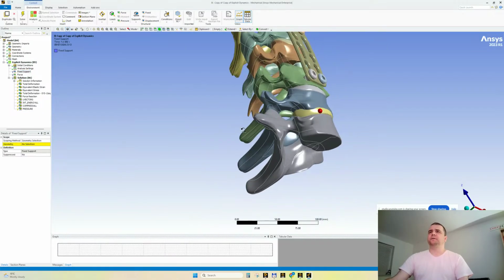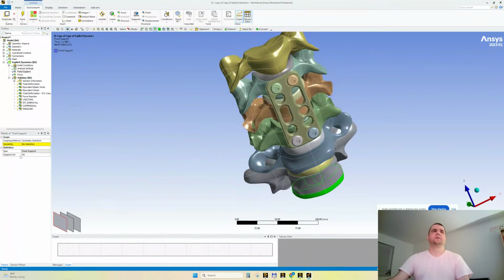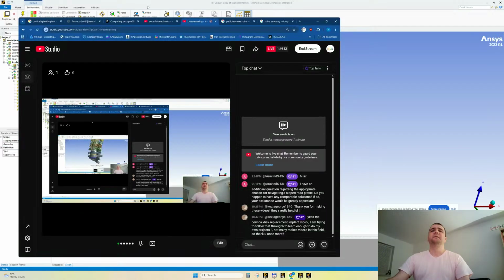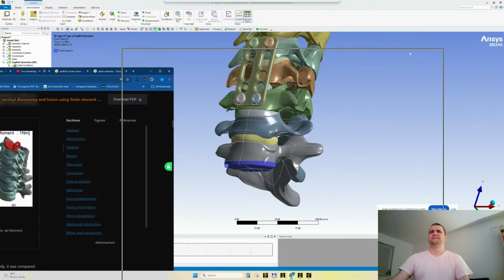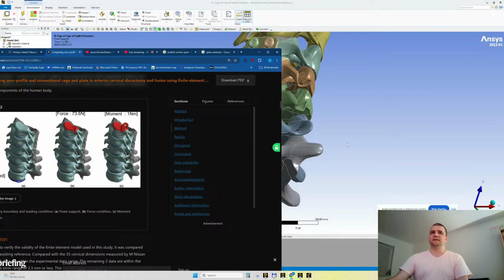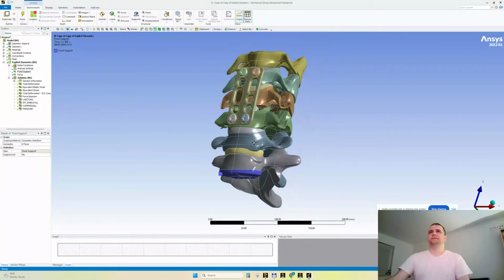In that paper, the bottom faces were fixed. Let's do as the paper says. Is it exactly as in the paper? Yeah. Did we use the same 3D model for the spine? Yes, I can bet. Yeah, it's exactly the same 3D model for the spine. All right. We have different implants after all.